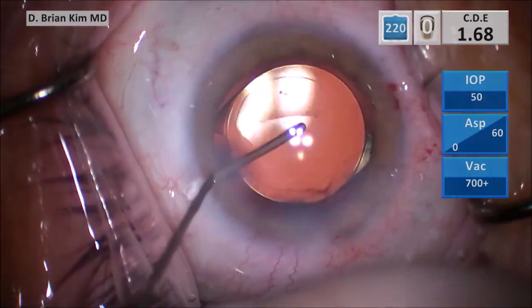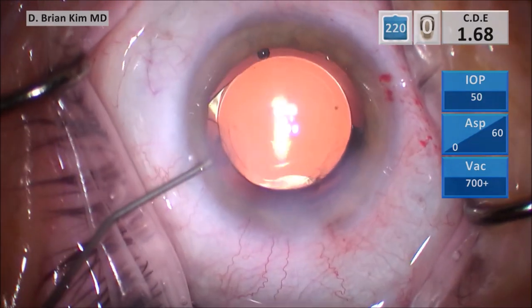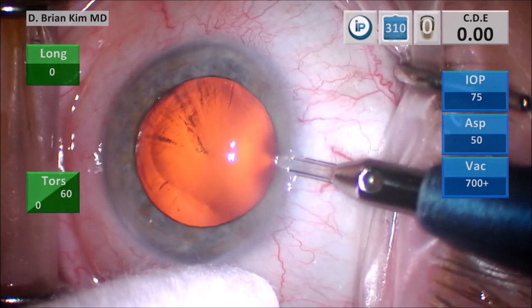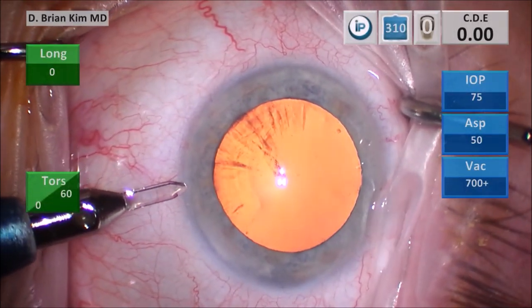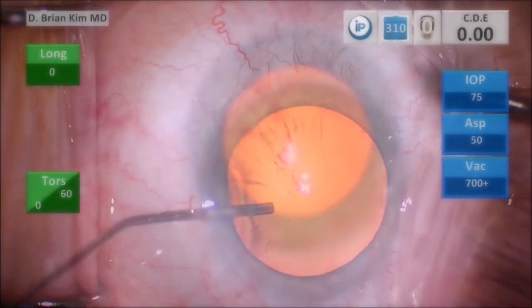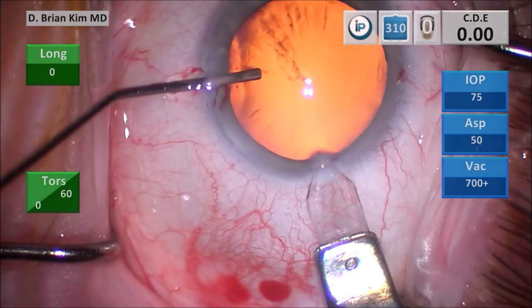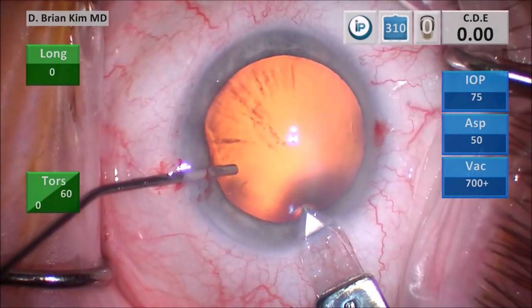I'm hydrating the sides of the incision and then the roof of the incision, sweeping side to side, then performing a similar technique for the paracentesis. Here's another case: use the cotton tip to pull the eye to the left, flattening the eye for a more flat approach, making the paracentesis parallel to the iris plane. Fill the eye with viscoelastic, then make my vertical groove, place the tip of the blade into the deepest part of the groove, tunnel through the cornea to the desired length, and then enter the eye.